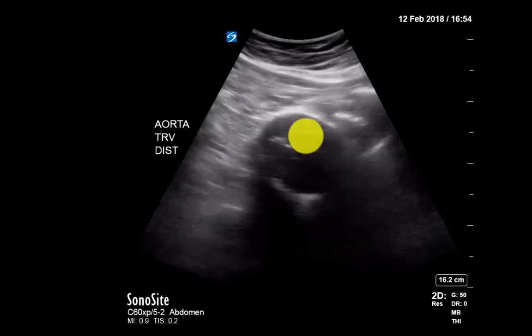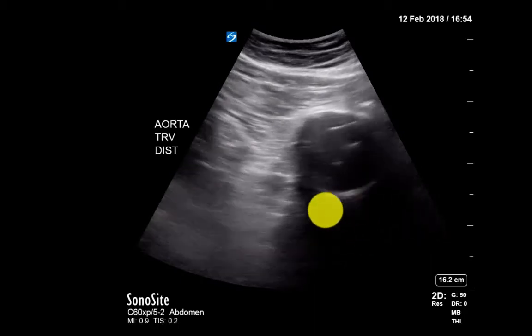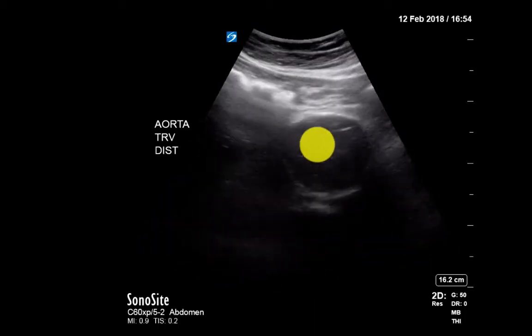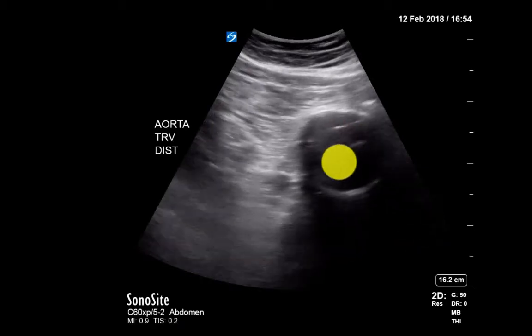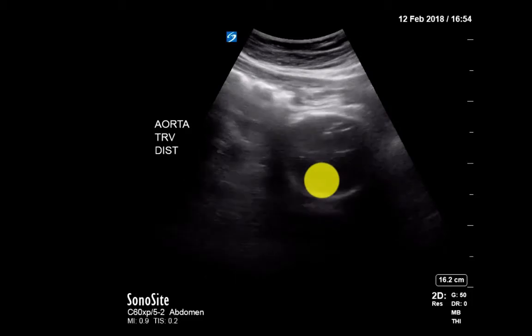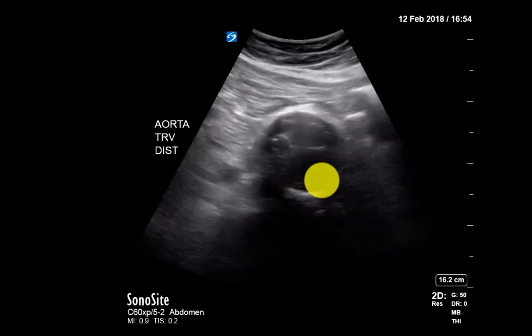You can see here is the aneurysm. The aneurysm is still present. You have a little bit of vertebral body back here. Not super clear, but you can see the components of the graft within the aneurysm sac. So measuring the graft components is not going to be of any help. Right? The Gore-Tex or whatever material they're made of, they're not going to enlarge.